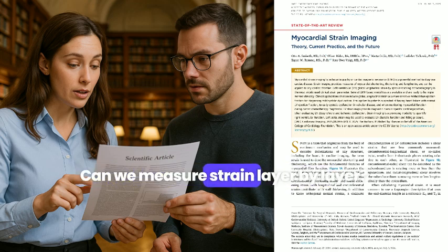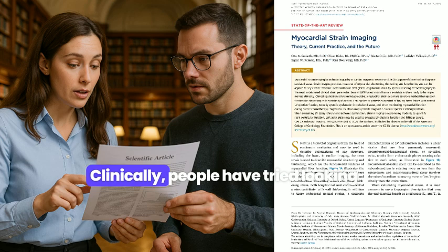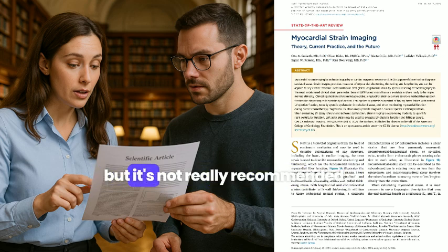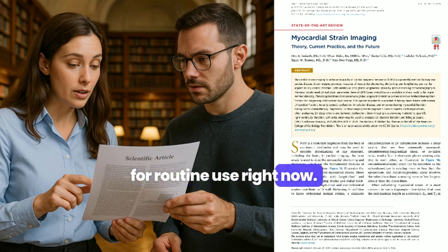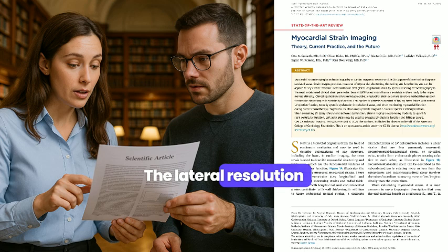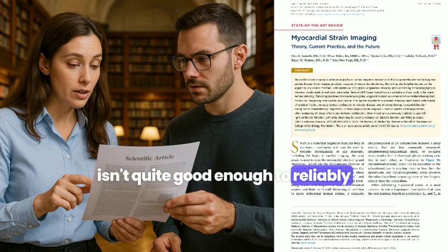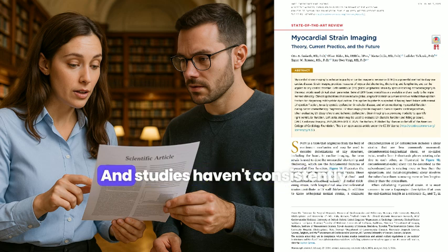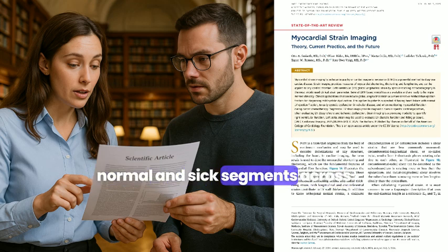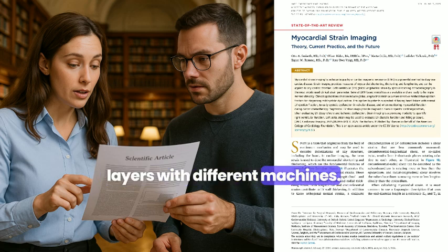Can we measure strain layer by layer clinically? People have tried looking at layer-specific longitudinal strain, but it's not really recommended for routine use right now. Why? Well, the layers are mechanically tied together, tethered. What one does affects the others. Plus, standard echo resolution side to side, the lateral resolution, isn't quite good enough to reliably separate these thin layers. And studies haven't consistently shown clear differences between normal and sick segments across layers with different machines.